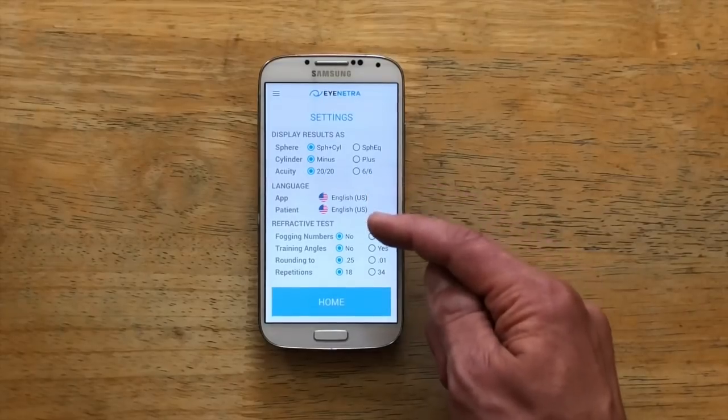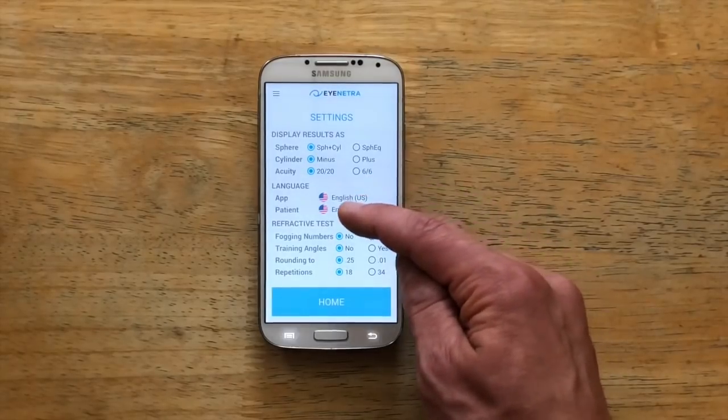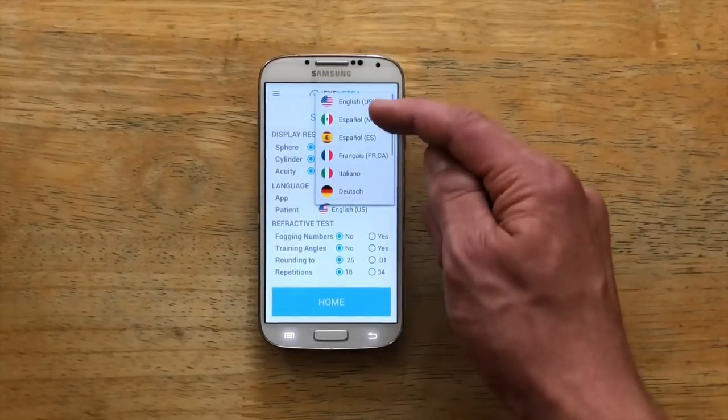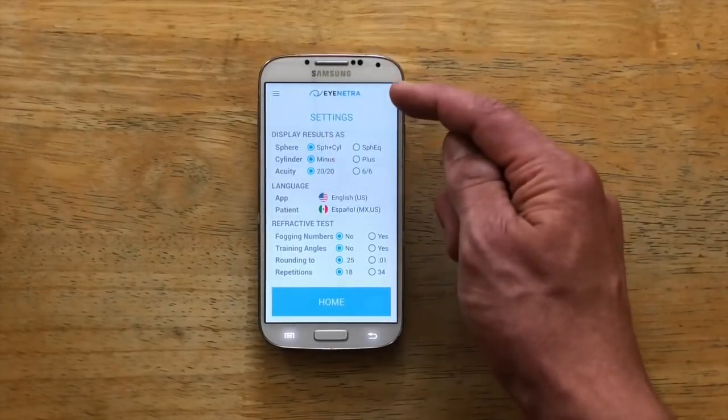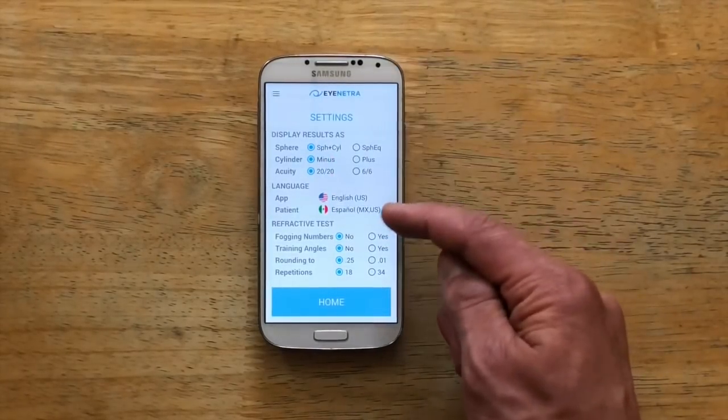In the middle, under Language, we can select the desired language settings. Here you can choose between the language of the app, which is the technician's native language, and the language of the patient if they differ.